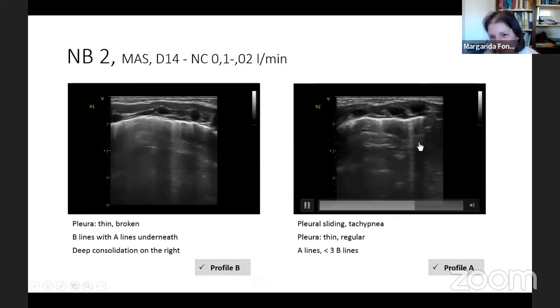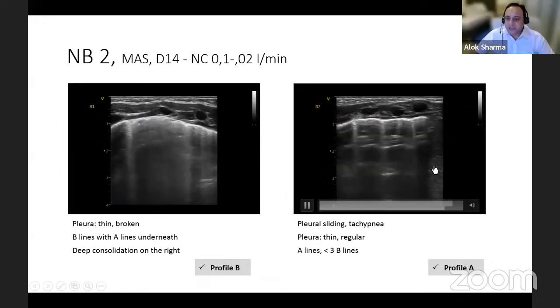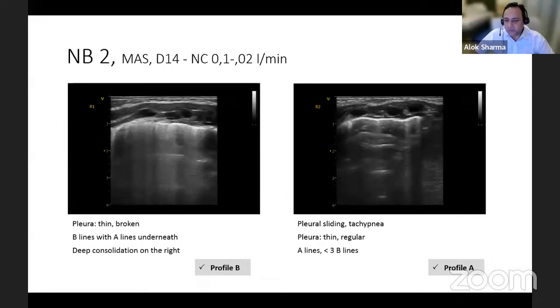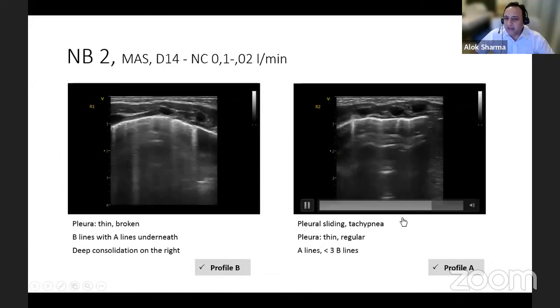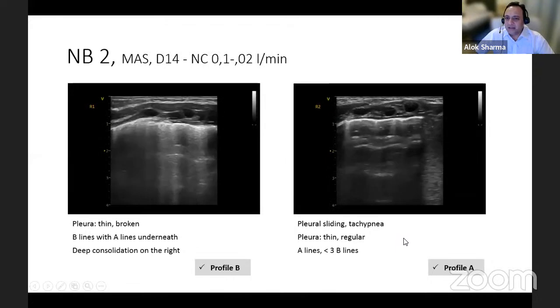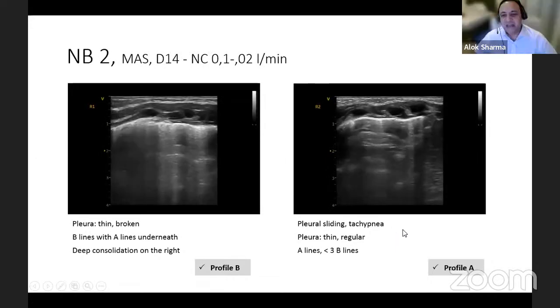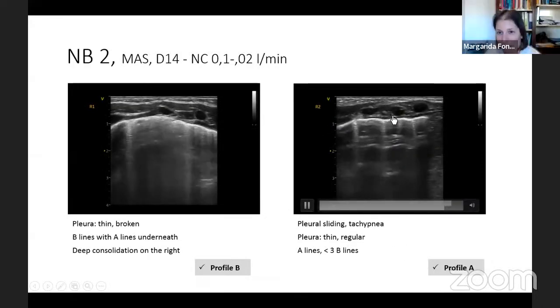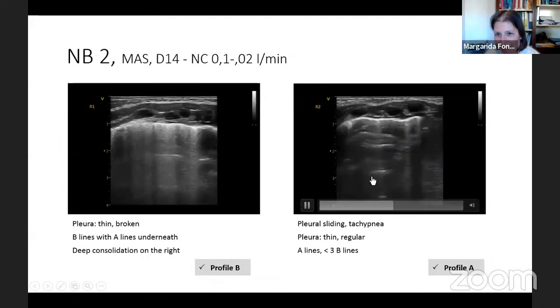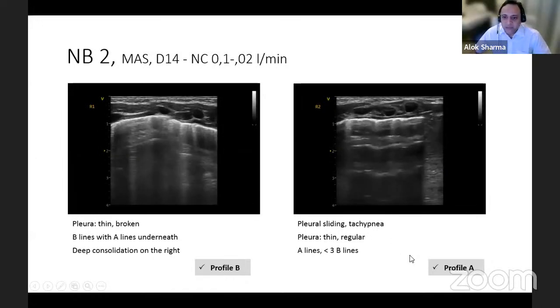Here, but right. Yeah, it has B lines, and the B lines move. So theoretically, from your perspective, it's very unlikely that you've got a pneumothorax there. Yes. You do have a little bit of what I'd say is lung pulse. Do you think there's a mild effusion there? Small effusion? Maybe here, yes. Yep, I just think you've got a tiny effusion as well. So very nice. I would agree with that.